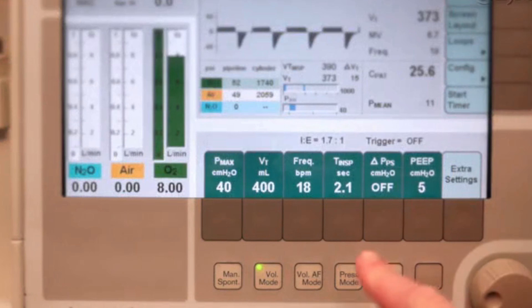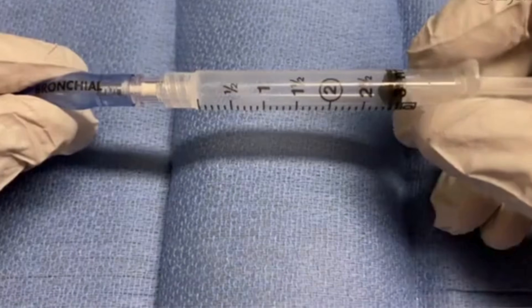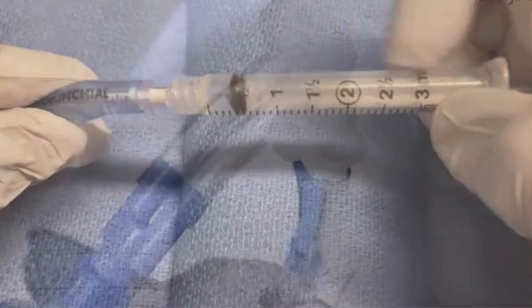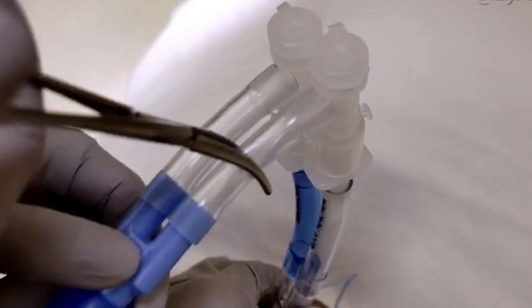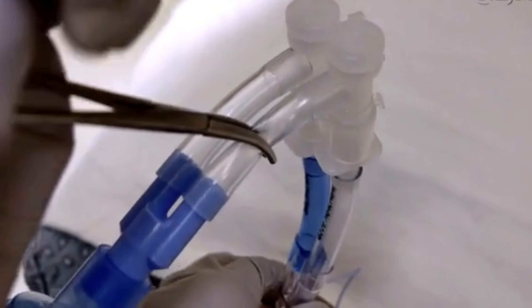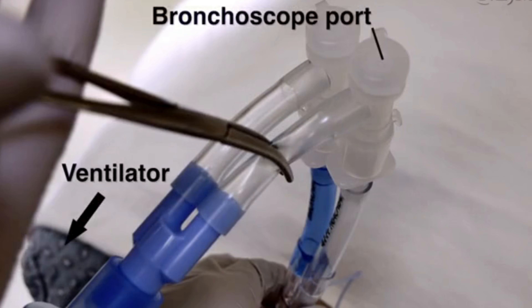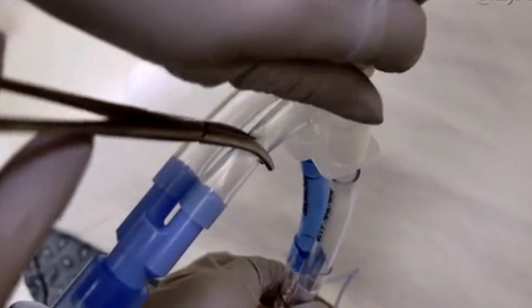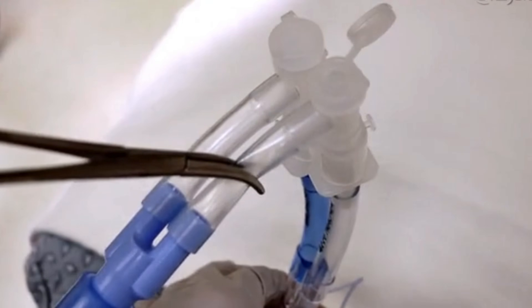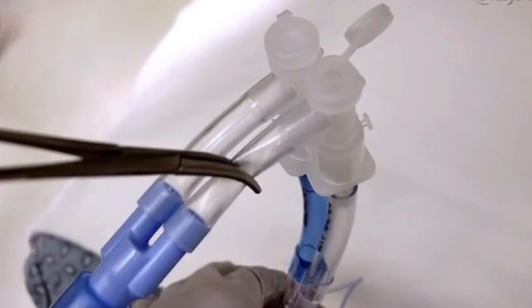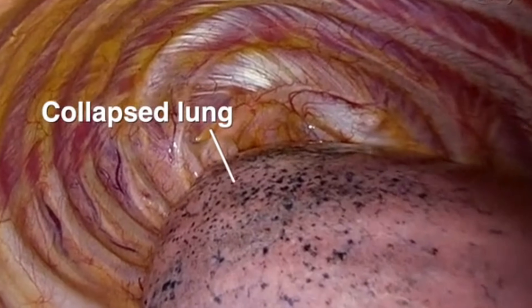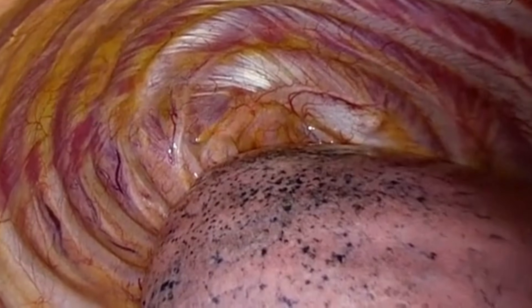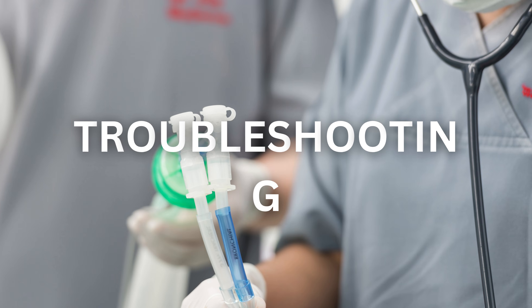Before you initiate one lung ventilation, adjust the ventilator settings and inflate the bronchial cuff. To ventilate the lung distal to the bronchial lumen, place a clamp on the tracheal lumen of the Y connector between the bronchoscope port and ventilator. Then open the bronchoscope port of the tracheal lumen, which is connected to the non-ventilated lung. This will allow the non-ventilated lung to collapse as the other lung is selectively ventilated.